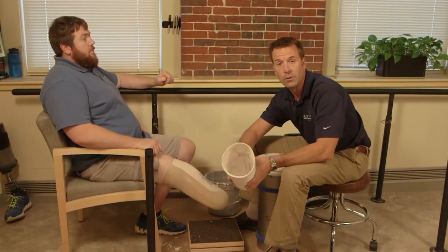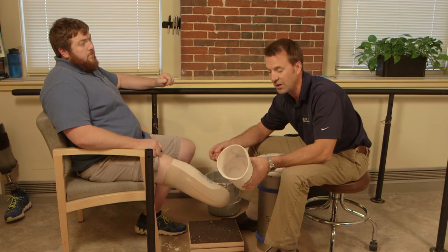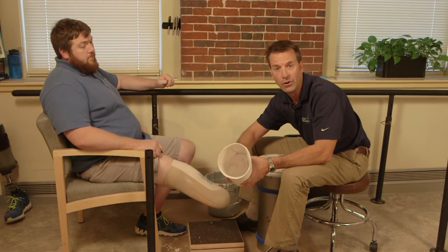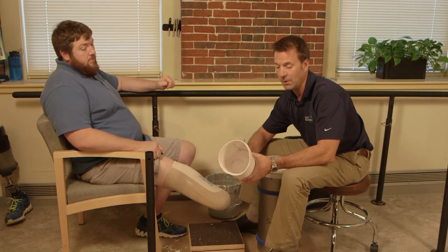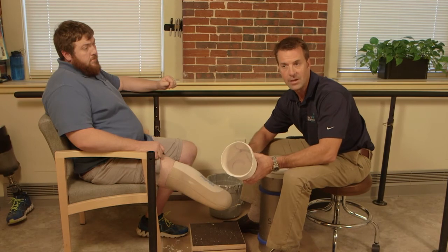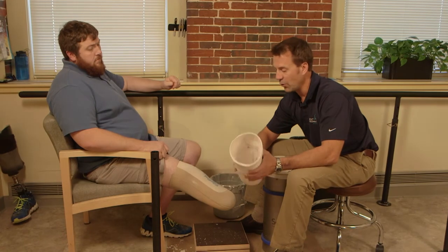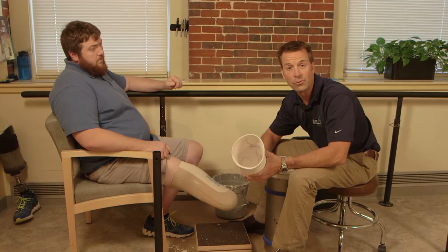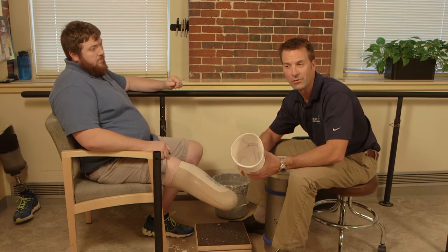As you can see, all of our markings have transferred over onto the inside of this cast, and it is an extremely accurate representation of his anatomical shape. We've been very excited and encouraged by the results that we have achieved so far with the Symphony system. I think that conceptually, to cast somebody under full weight bearing makes complete sense. If you are interested in the Symphony system, we encourage you to contact us through either our website or by phone call. Thank you for taking the time to watch our video.